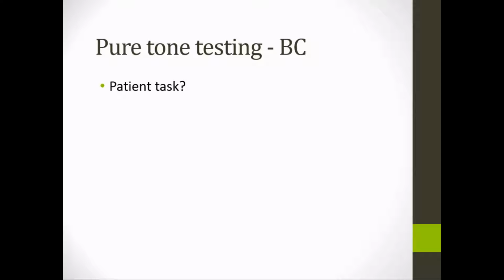So just a quick review. The patient task for bone conduction testing is going to be the same. Their task is simply to let you know in some reliable way that they've heard the tone. The transducer we're going to be using is the bone oscillator. That's the only transducer that's capable of doing bone conduction testing.